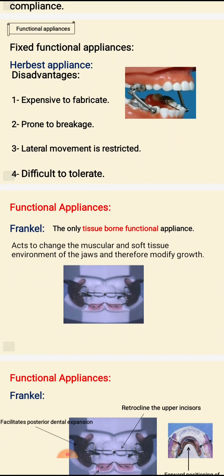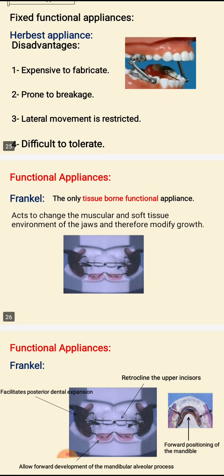So now we will talk about the only tissue-borne functional appliance, Frankel. It also acts to change the muscular and soft tissue environment of the jaw, and therefore modifies the growth.